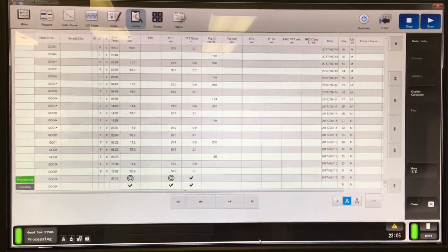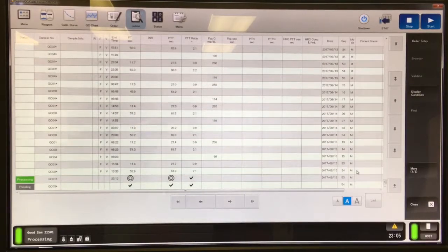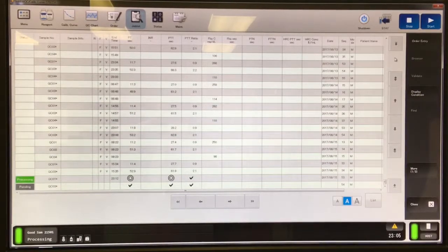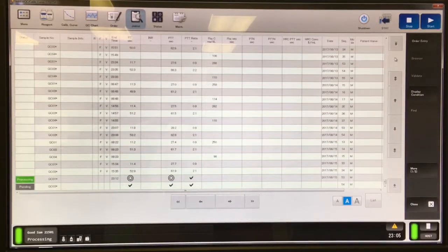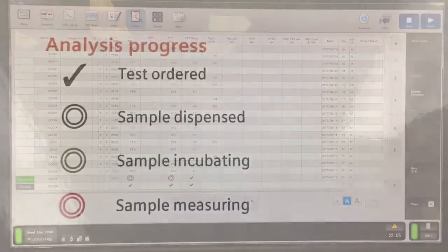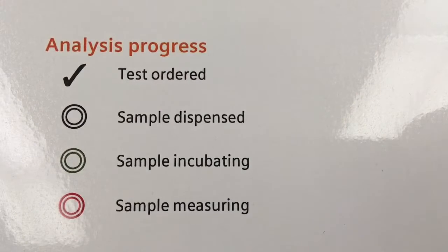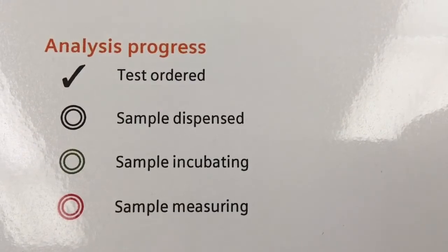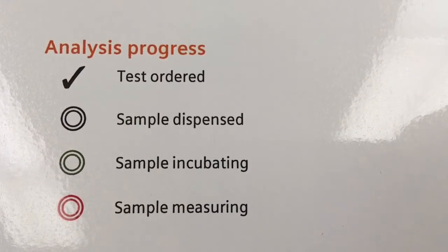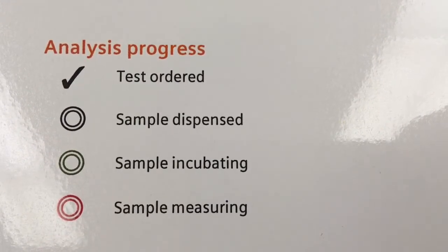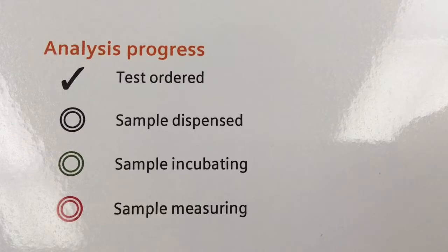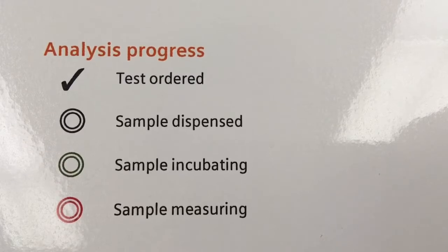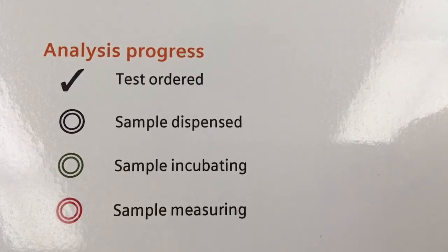Down here at the bottom, you can see they change depending on what the instrument is doing. A check mark means the test has been ordered, the black circle means sample is dispensed, green indicates sample is incubating, and red means sample is measuring.